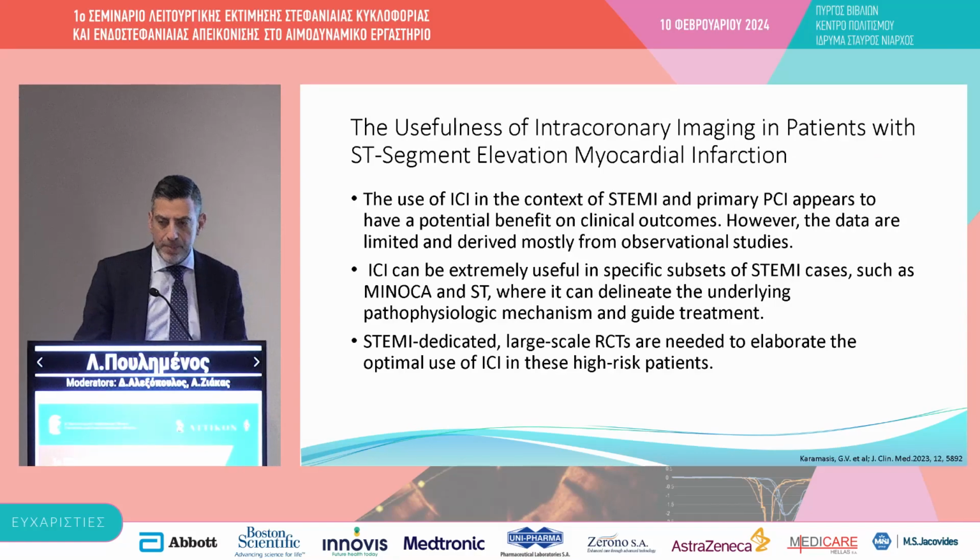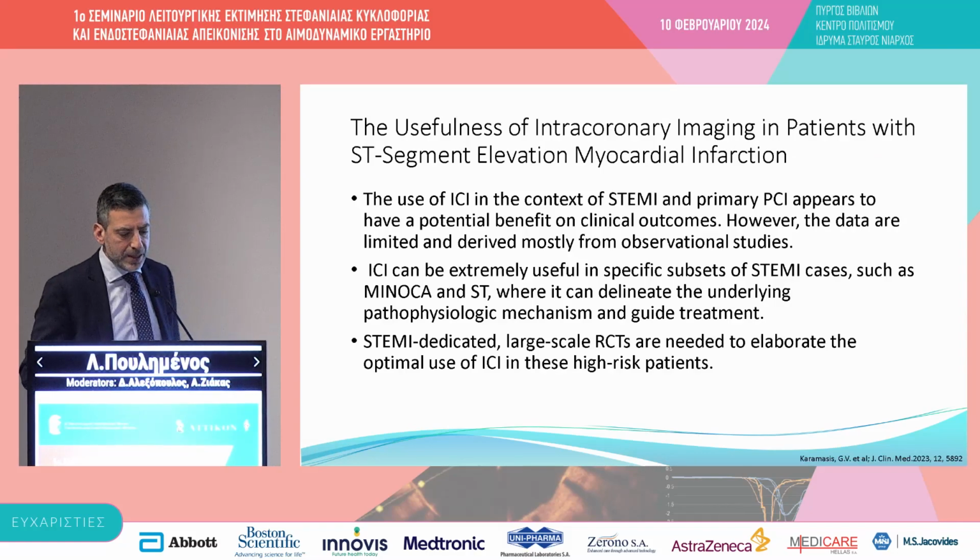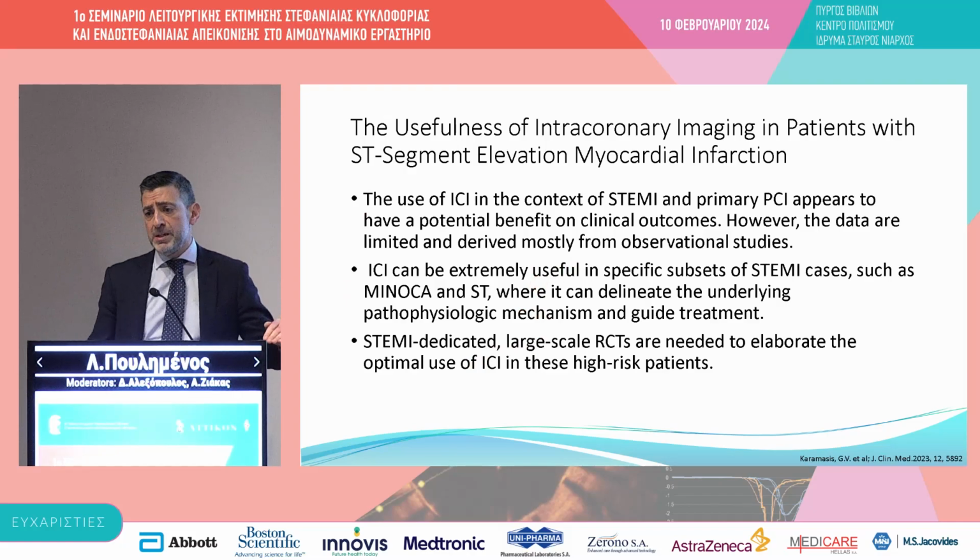Here's a paper by Grigoris and the team of Attico on the use of intracoronary imaging in patients with ST elevation myocardial infarction. We don't have many data indeed, but in patients with MINOCA and stent thrombosis, imaging is imperative in many of them.